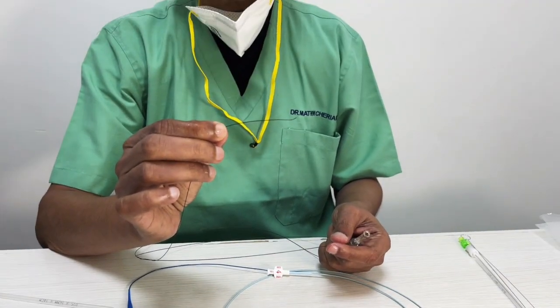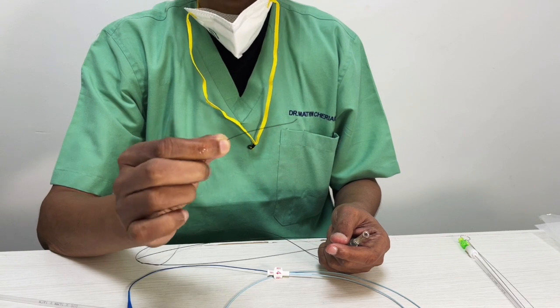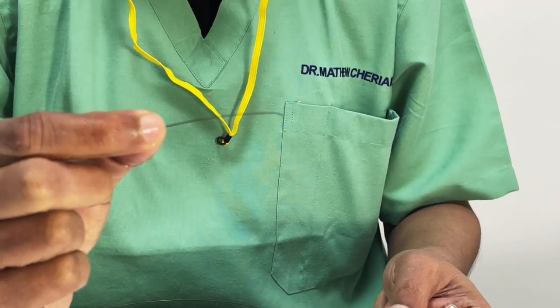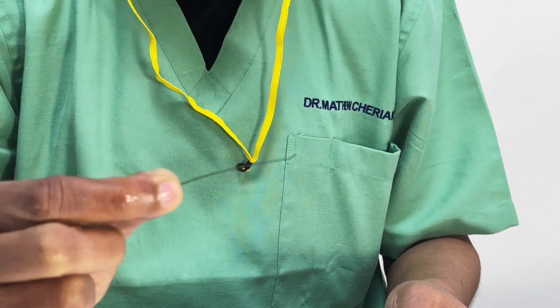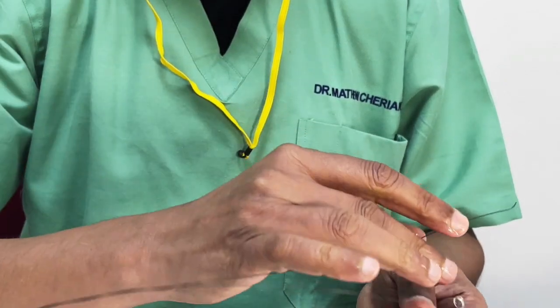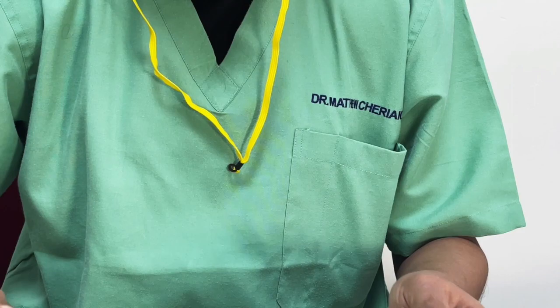And since there is a space between the lumen and the coil, this tip will sometimes get stuck between the coil and the micro. Don't get worried about that. All you have to do is keep pushing till the wire exits and it automatically detaches the coil. Having said that, it's not appropriate to use it that way, but we can use that. The ideal micro is a 2.1 microcatheter.